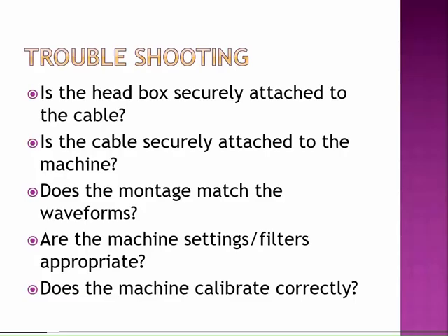Did you turn the computer on and choose the right type of study that you needed? And sometimes, for whatever reason, when we go into the systems, the filters might reset and all go to zero, and you have to go in and turn them back on. So are the filters set appropriately? Does the machine calibrate? We want to calibrate everything. So this is one of those instances where I really want to stress the importance of the impedances. They don't tell the whole story.